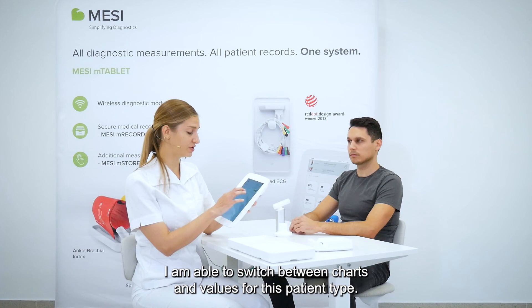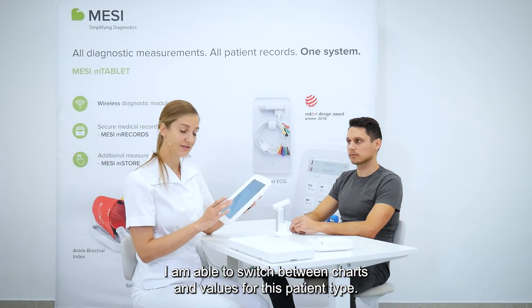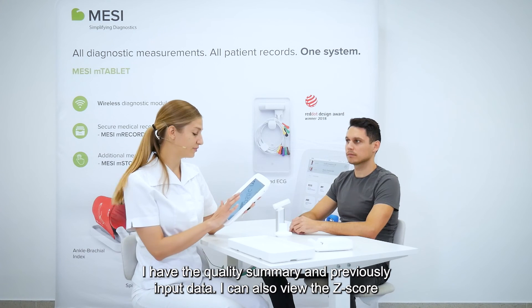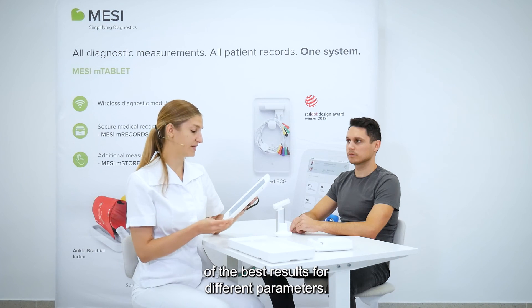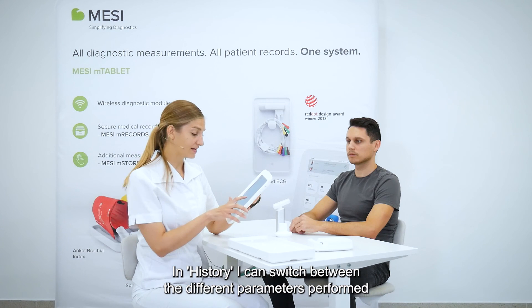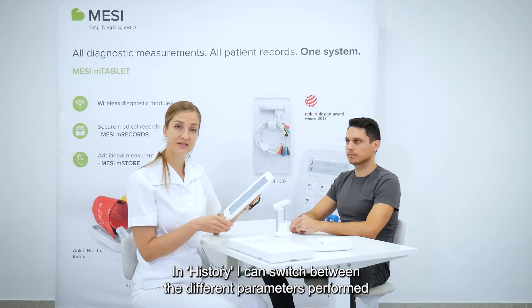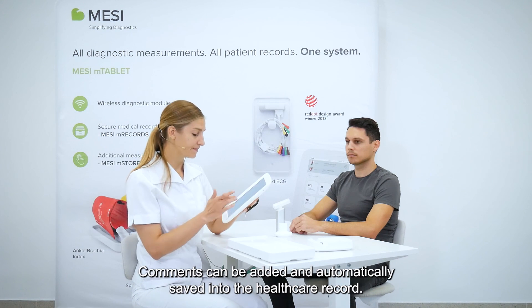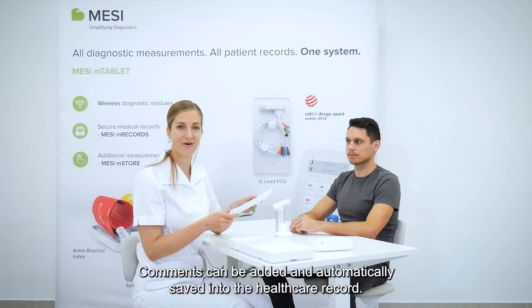I am able to switch between charts and values for this particular type of patient. I have the quality summary and the patient data that I previously input, and I can also review the Z-score for the best recording for different parameters. In the history, I can switch between the different parameters and monitor how this patient's status is progressing. I can add any comments, and when I'm done, it is automatically saved into the patient's healthcare record.